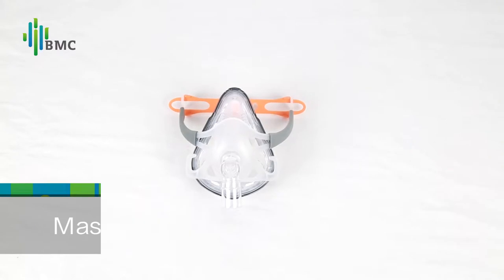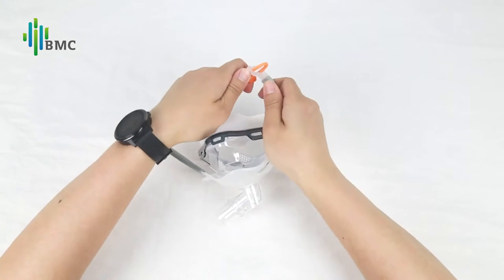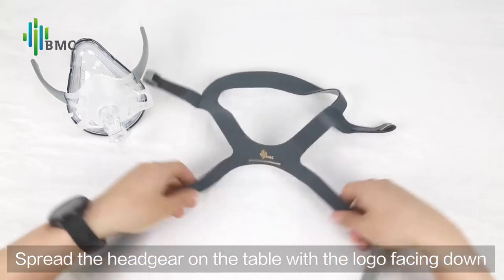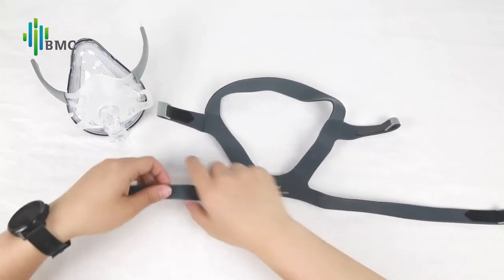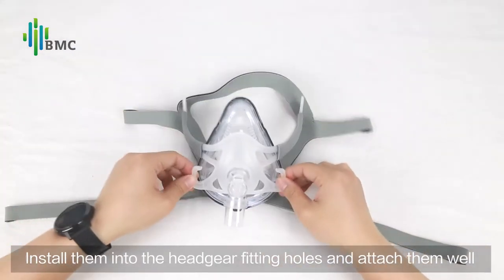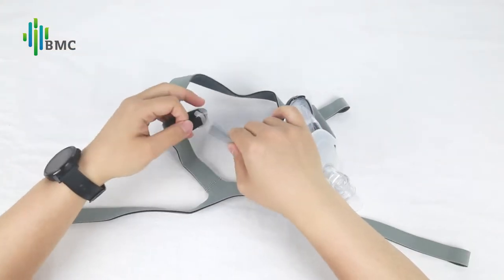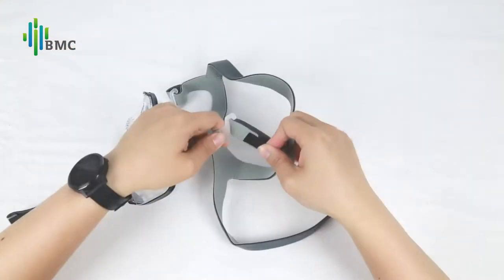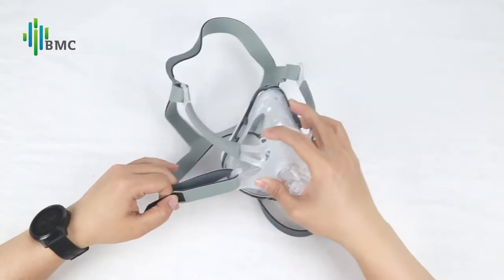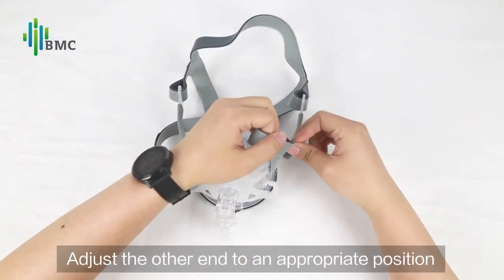Mask Assembly: take off the supporting frame from the mask. Spread the headgear on the table with the logo facing down and put the short ends upwards. Install them into the headgear fitting holes and attach them well. Connect the unilateral headgear below and adjust the other end to an appropriate position.